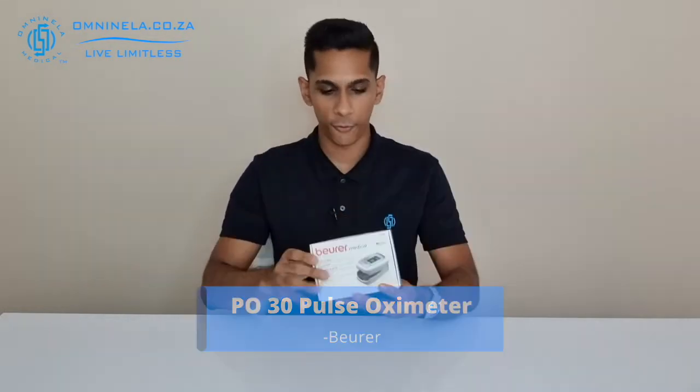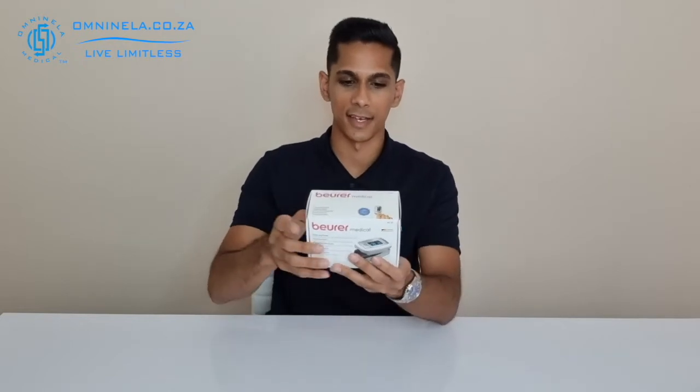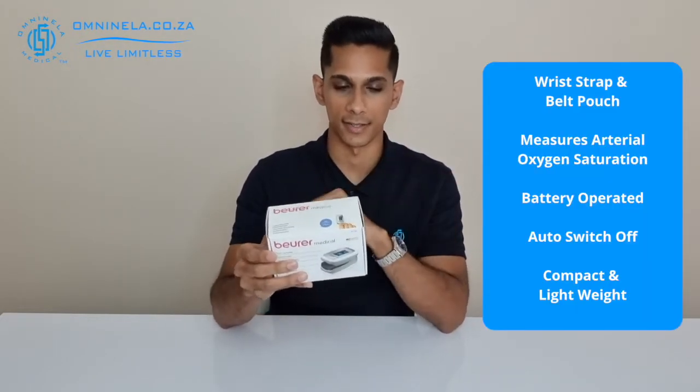For this we'll have a quick look at the features of the device itself and also what comes included inside of this packaging. Having a look at the outside of the box, we can see that this is for the oxygen saturation and also your heart rate sensors.